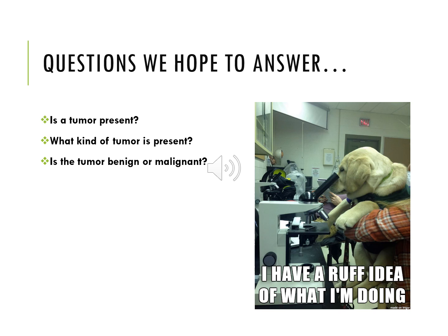So when we're looking at cytologies of different neoplasms, the questions that we want to answer are: is there a tumor present? What kind of tumor is present? And then is that tumor benign or malignant? Hopefully we'll be able to answer those when looking at an aspirate. We're not always able to, but these are the goals whenever we look at a cytology.